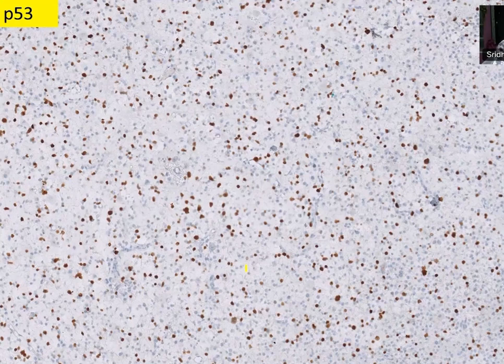So there are two ways of detecting mutation. One is strong intensity staining cells. The other is absolutely no cells staining. Here you get P53 positivity, overexpression, so likely to be P53 mutant. We don't know, but this is a surrogate, probably a P53 mutation because of the overexpression which is not seen normally.